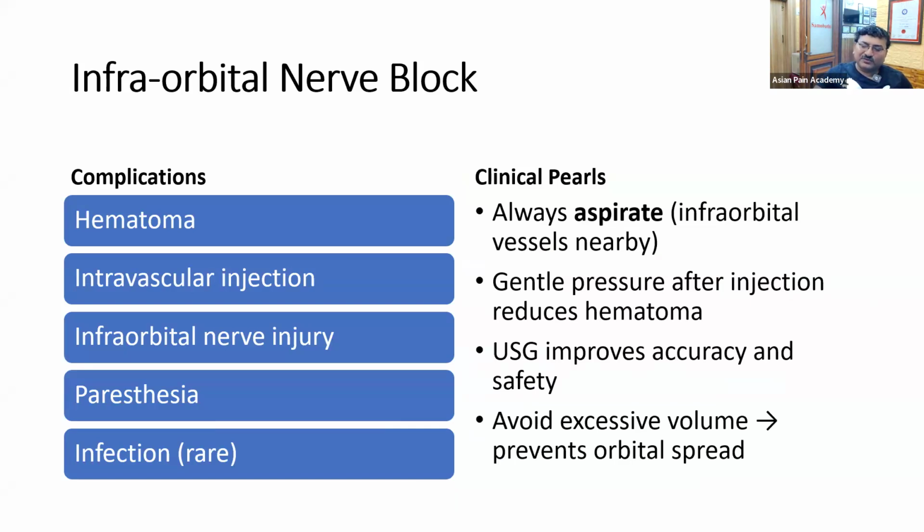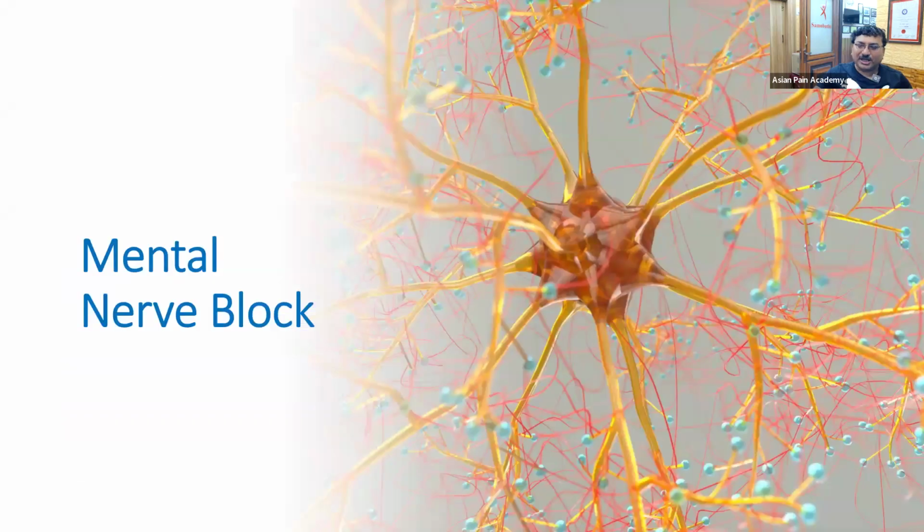Ultrasound is definitely improving the accuracy. In case you are intravascular, it might show. If there is a formation of hematoma, it will show. So ultrasound helps along with the blind procedure.